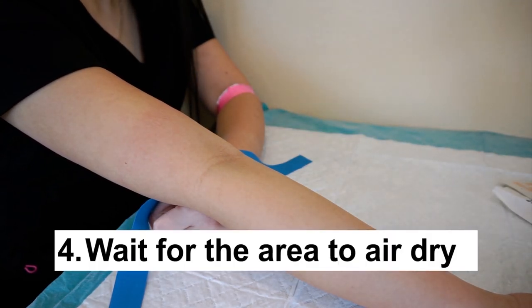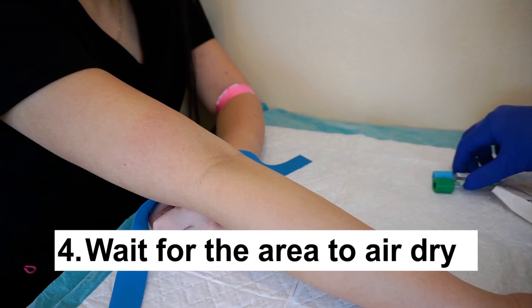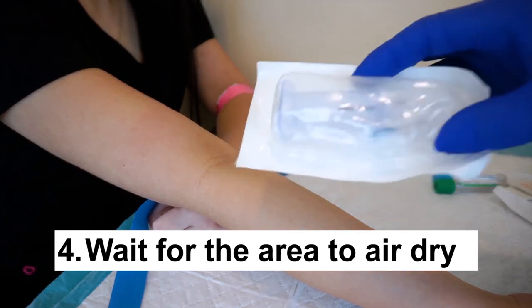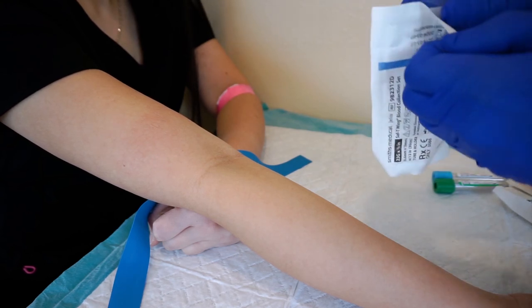Fourth, wait for the area to dry before puncturing the vein. Do not blow or wave because you will reintroduce bacteria to the drawing site. During the wait, you can prepare the gauze, bandage, and blood collection tubes in the correct order of draw.